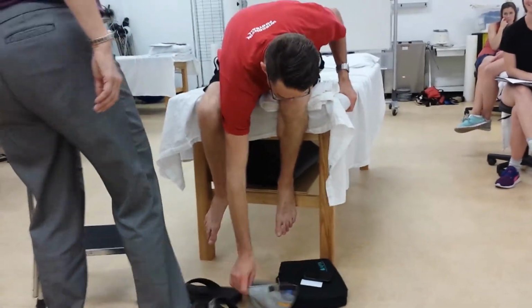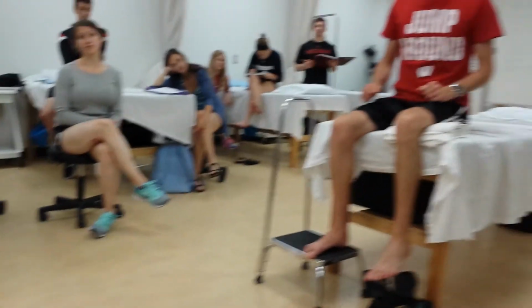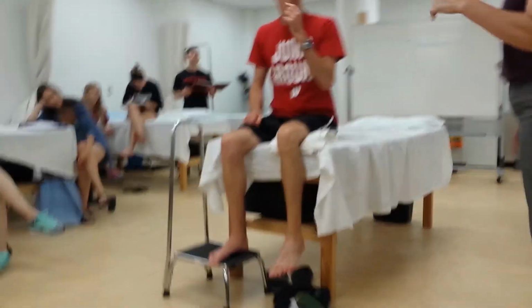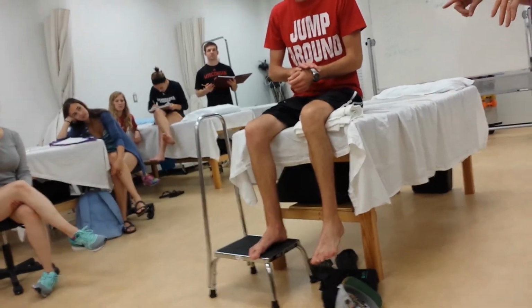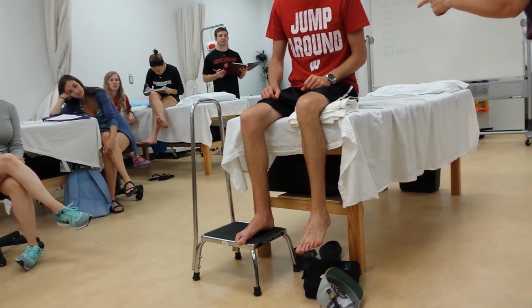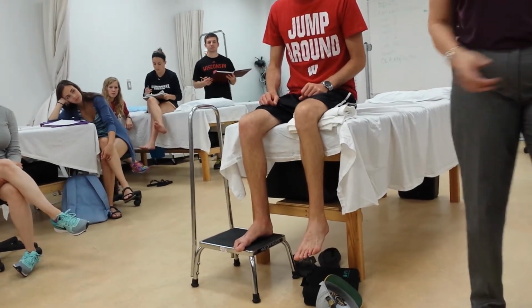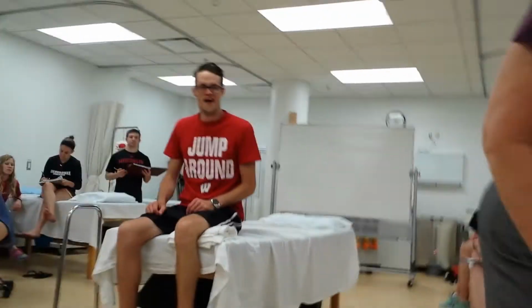Okay, here's a gasp. We have gasps. You're okay. There you go. If you remember in 356, we have low mat tables. Measuring hip rotation on those tables is very, very difficult to do. So it's a lot easier on these higher tables. I have a stool behind you. Or I can take yours.